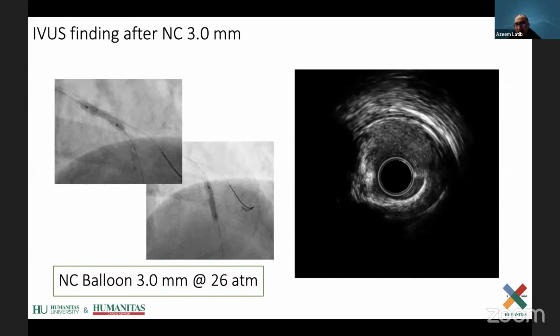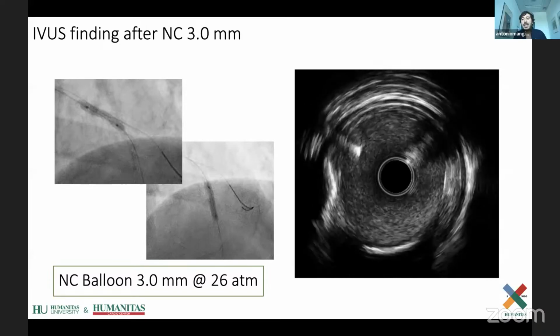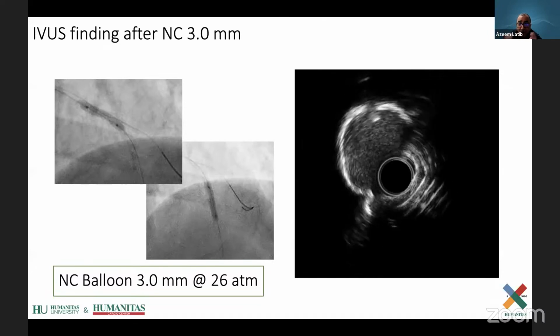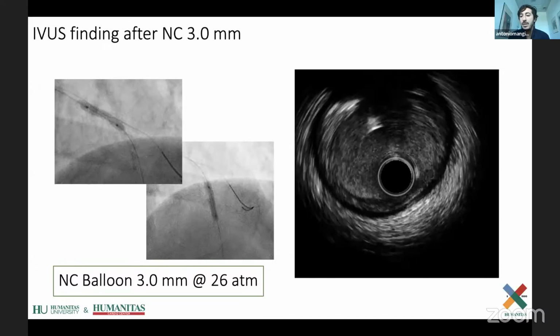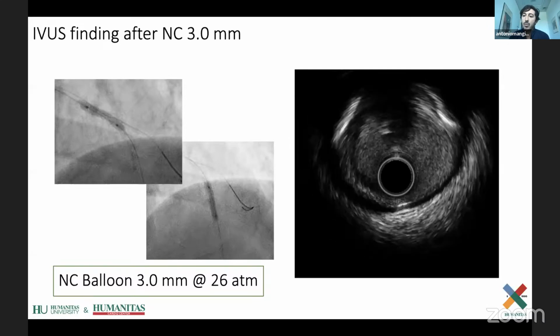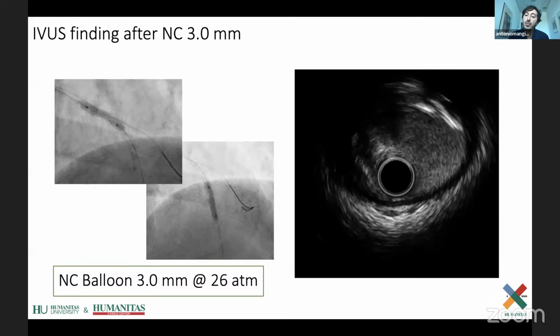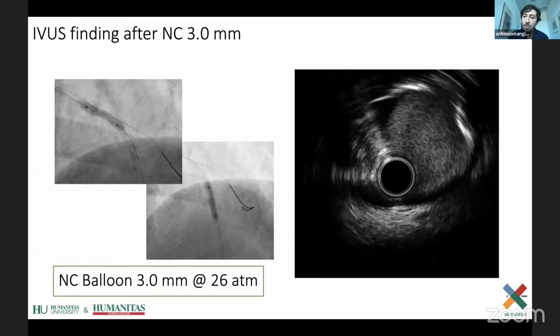But even in your study in COPS, you had a numerically higher perforation rate with cutting balloon versus non-compliant. So this was not significant from the statistical point of view, but in our study, we treated 42 patients and we had 2 Ellis type 1 perforations.